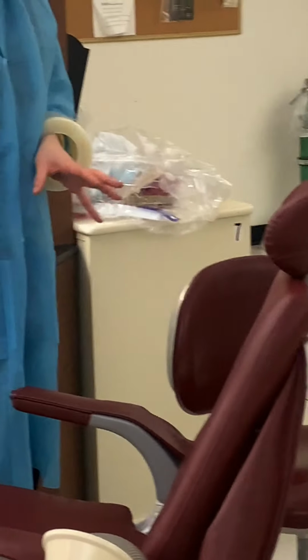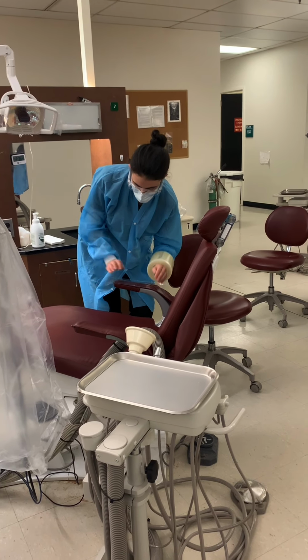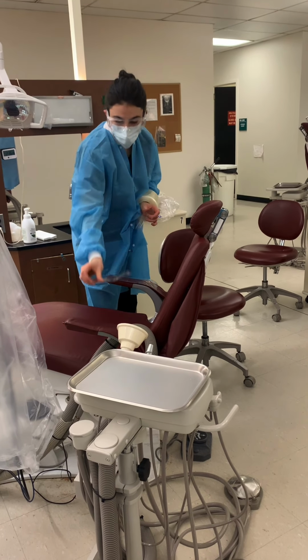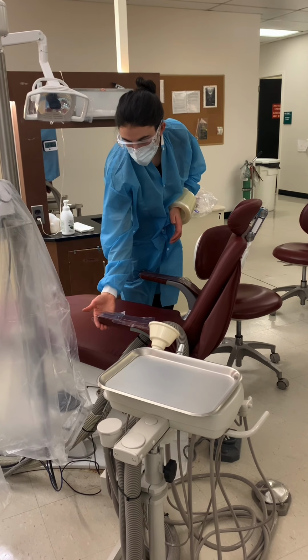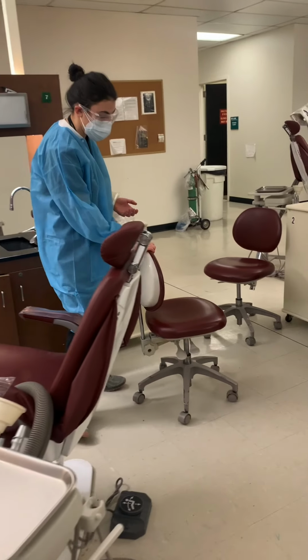My office also puts barriers on the handles of the unit. So we get two, and we lay it like that, tuck it under, because typically people put their fingernails under, they grasp around, so we usually do two in my office. Grasp under.